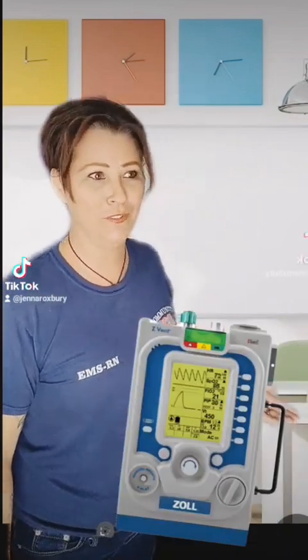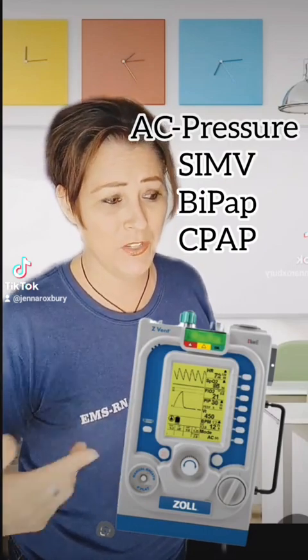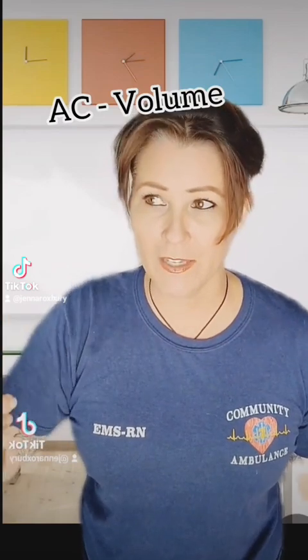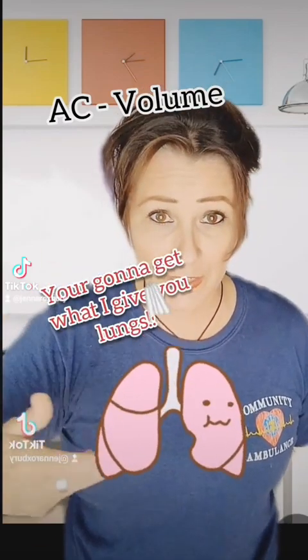Okay, you've got your patient. They're not breathing. You need to breathe for them. And in order to do this, I use the Zoll. There are multiple modes that you can use on this ventilator, but I'm just going to talk about the one that we use most commonly, which is assist control volume. Assist volume control is we tell the lungs how many milliliters of air they're going to get per breath.